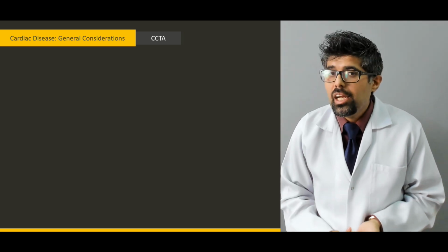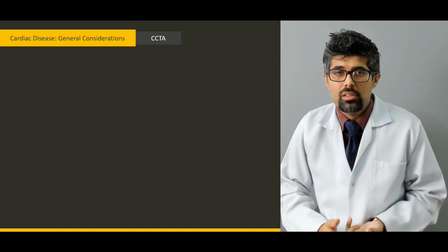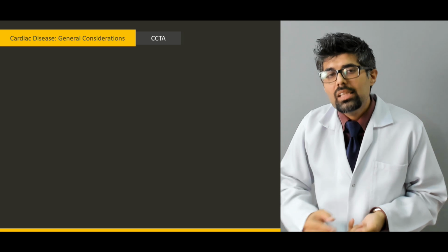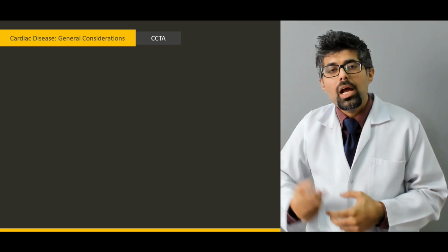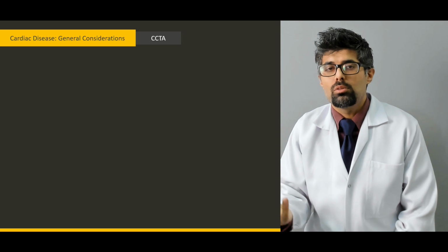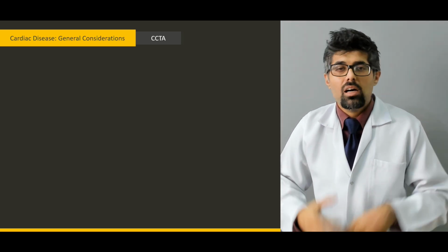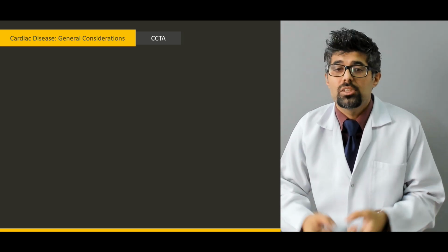In CCTA, what we do is use an iodinated contrast, and that contrast is circulated throughout the heart, and a multitude of pictures are taken through CT scan, composed, and an idea is given of how those vessels look.